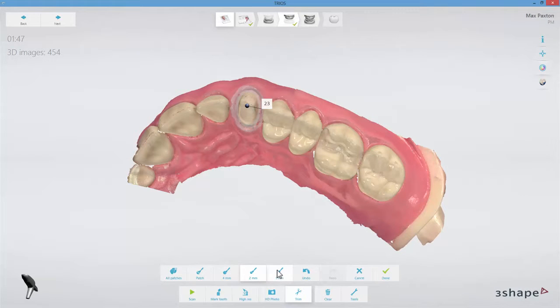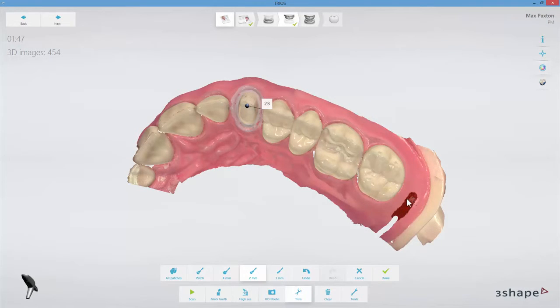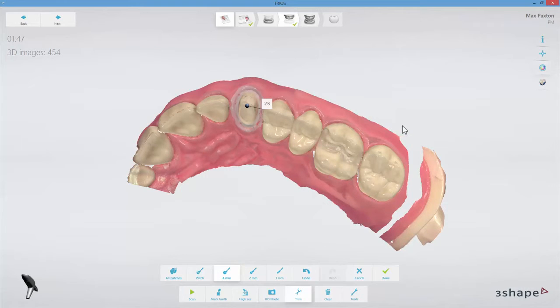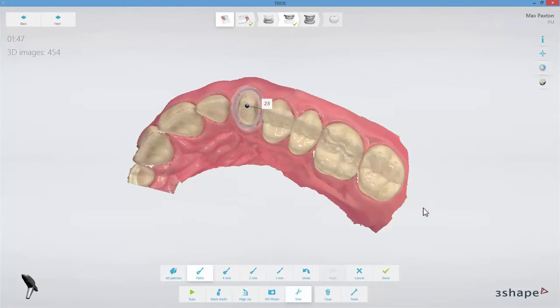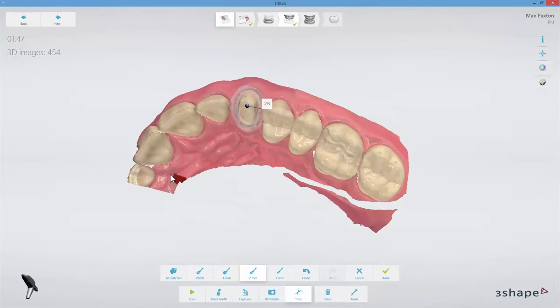You can use Brush with different thickness options: 1mm, 2mm, or 4mm, or Patch to remove a free-hanging island by clicking on it. You also have the All Patches tool, which automatically removes all elements that have slim or no attachment to the main surface.